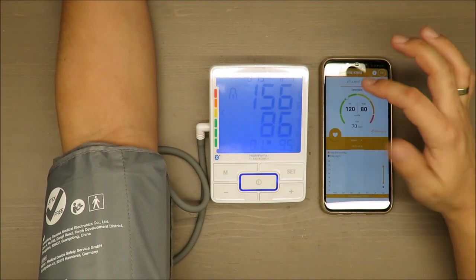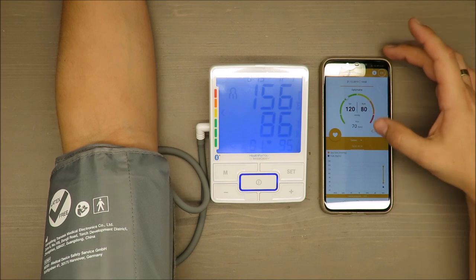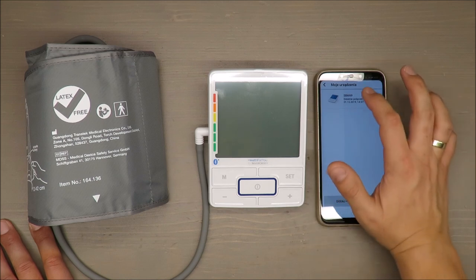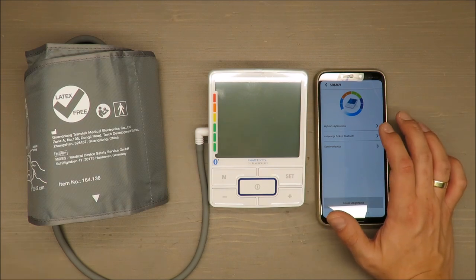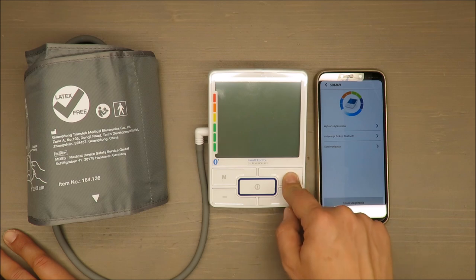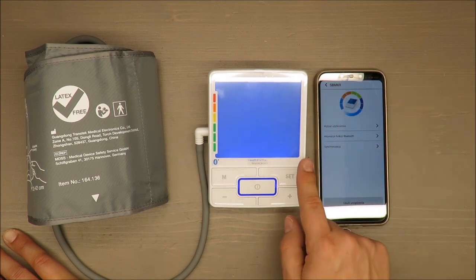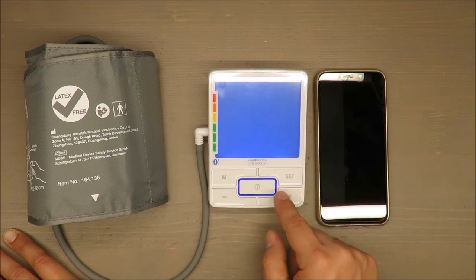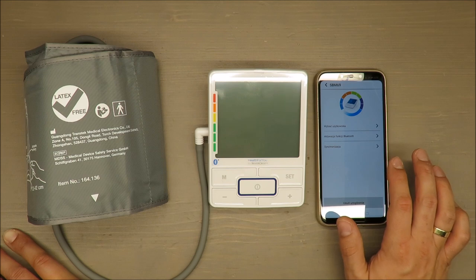Okay. It should connect. I don't know why it's not connecting. Okay, I have synchronized it properly. How to activate the Bluetooth function? Very quick. You need to hold this button for at least 5 seconds, then it will turn on. Press it again 6 times and it's Bluetooth on or off. You have to leave it on and confirm by pressing the set button again.